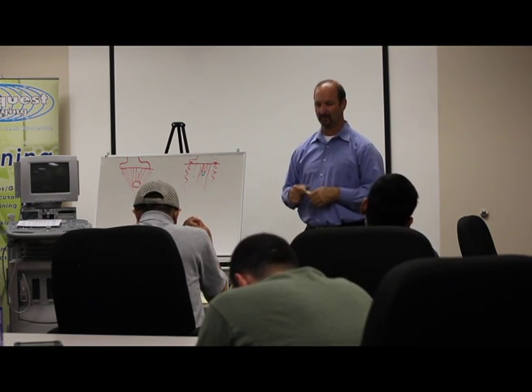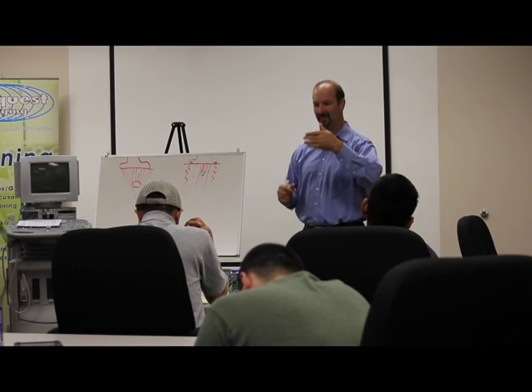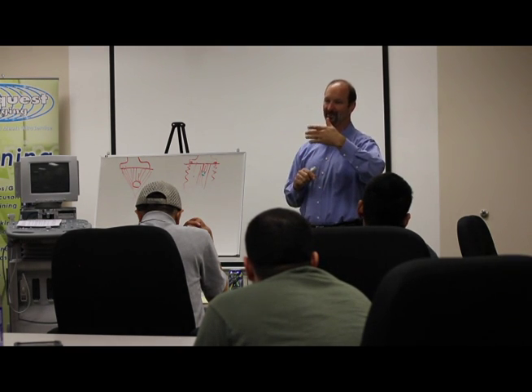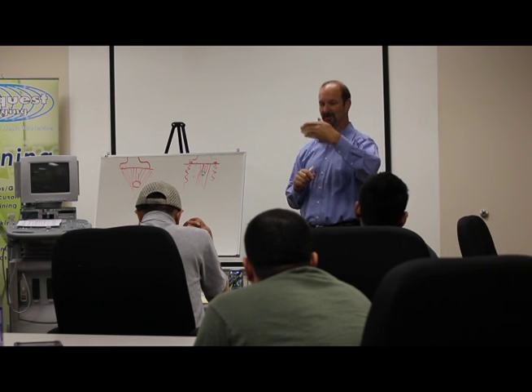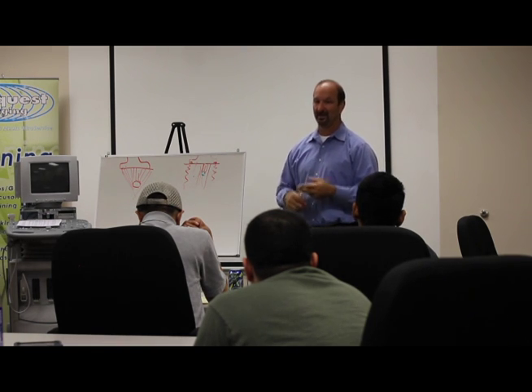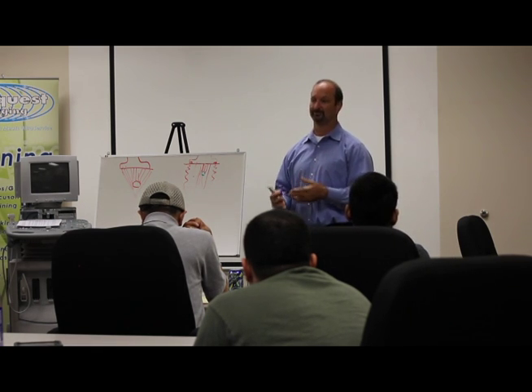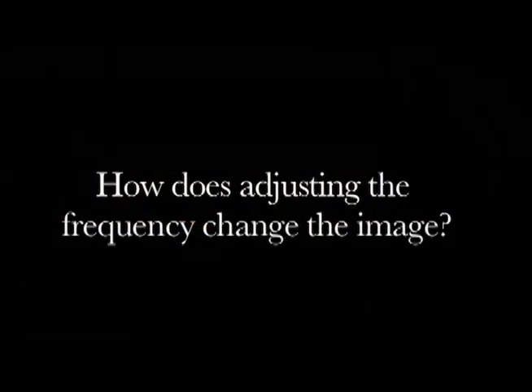So, next time you're testing a transducer, 15 LAW on a phantom, run it at 14 megahertz, see what it looks like, and then turn on compounding at 14, HC14. Boom, you'll pull in the smaller information. For people selling transducers, that's why that transducer or the machine that'll do compounding is worth more. Because, I mean, it's more information.